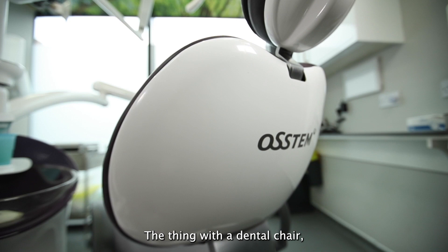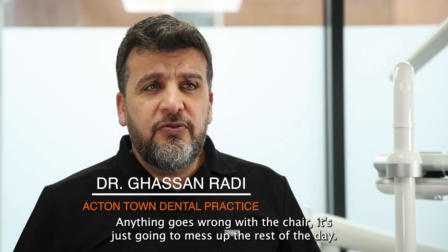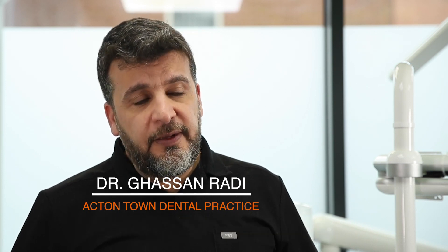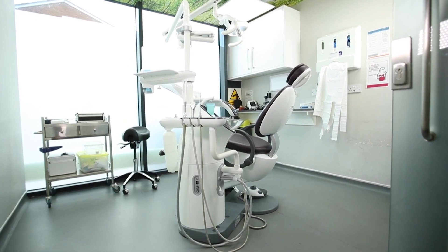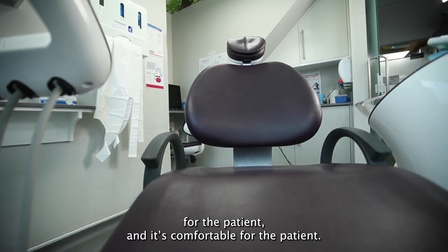I think with a dental chair, fundamentally it's your workhorse, so if anything goes wrong with the chair it's just going to mess up the rest of the day. So we're looking for something that's robust, simple. Aesthetically it's really nice — obviously that's important for the patient, and it's comfortable for the patient.